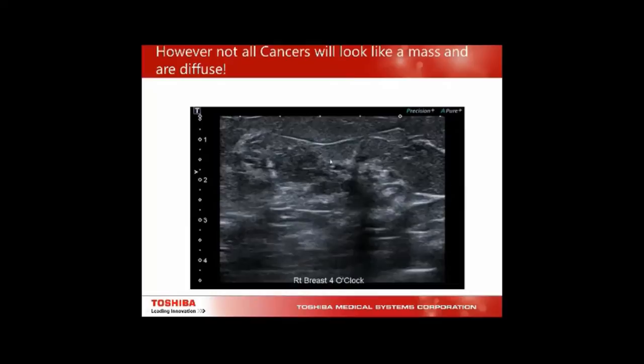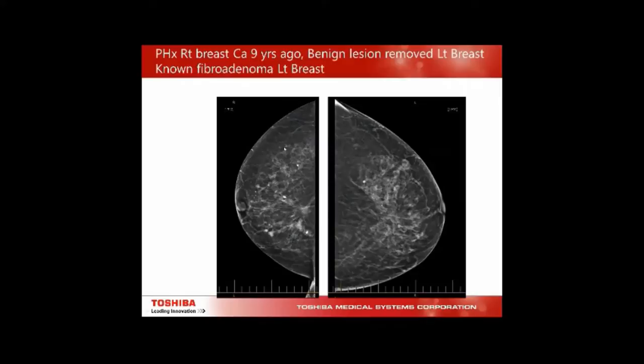Not all cancers look like a mass — some are diffuse, bigger than the probe, and you can't differentiate them out. You must look for normal anatomy to diagnose the abnormal. This patient had breast cancer at 10 o'clock in the right breast; working with the radiologist, there was an area of interest at 4 o'clock. Scanning through, I'm trying to identify the actual ducts — we can see a duct here, but then it's discontinued, and then we're picking up ducts again over here. In real time you could appreciate these little microcalcifications.